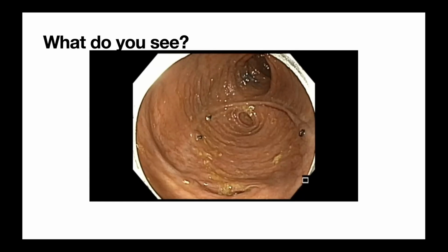Right. Okay. That's good. Let me ask Selby what her thoughts are. Thank you, Raju. Sylvia, I think, summarized it beautifully. This is a lady with multiple tubular adenomas, no other types of polyps that have been removed.